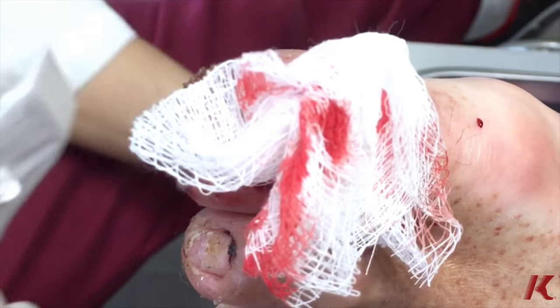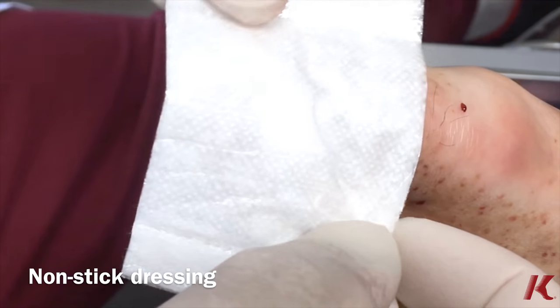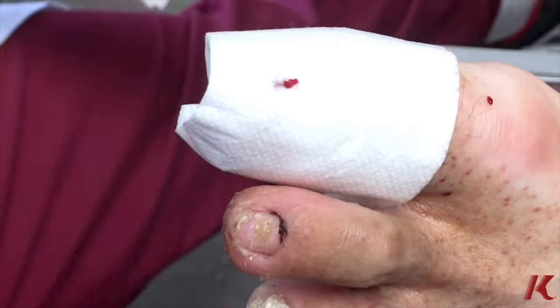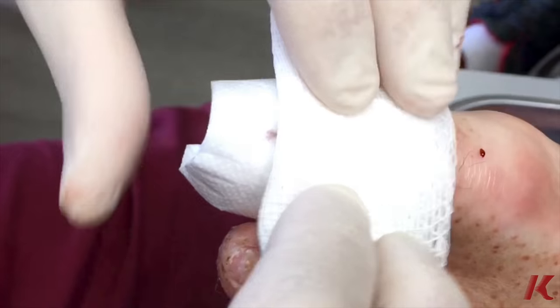For when the entire nail is removed, I like to put a non-stick dressing. That's what we're doing here, because regular gauze will sometimes stick to the wound. I like to put a non-adherent dressing with some topical antibiotic, and then we're just going to put a compression wrap on the toe.